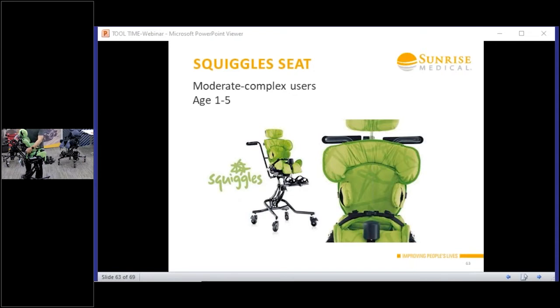You've got your lateral adjustments, so on the rear of the chair. Again, these handles are just in the wrong position. Sorry guys, just trying to get you the best view. Okay, so the lateral adjustment is here. Rob's just seeing if we can easily remove those handles for you so that you can see what we're doing, so you can just see on the back.